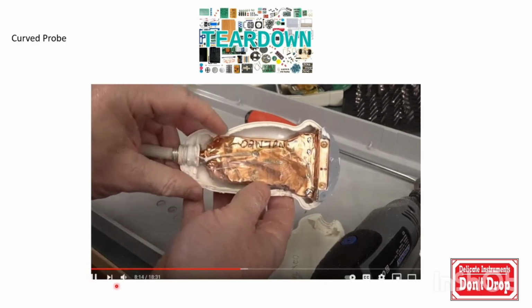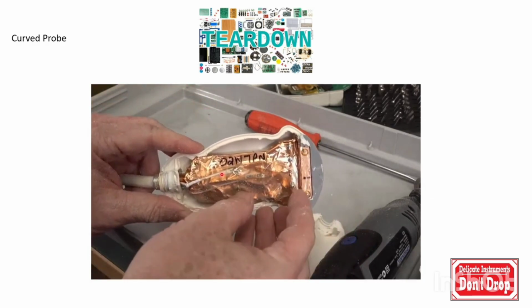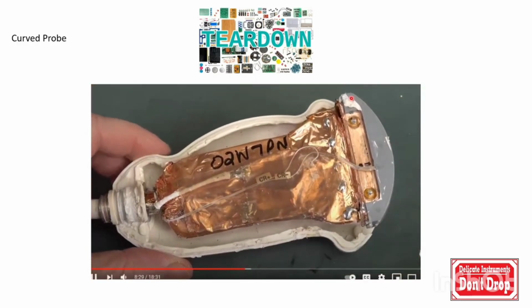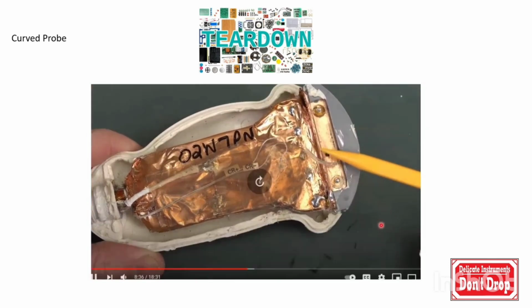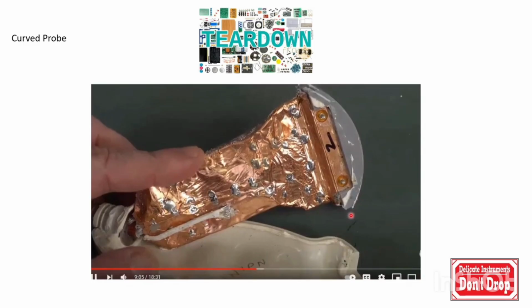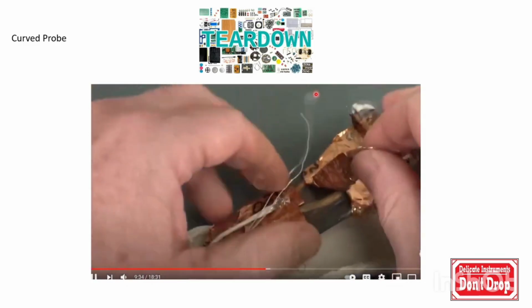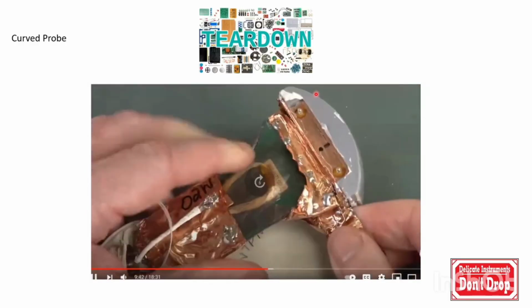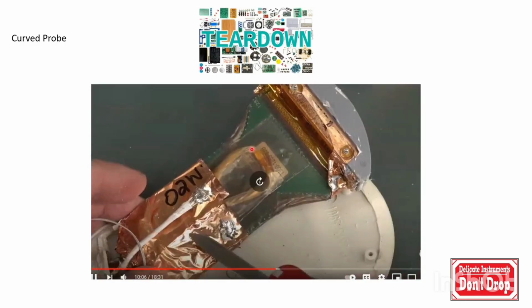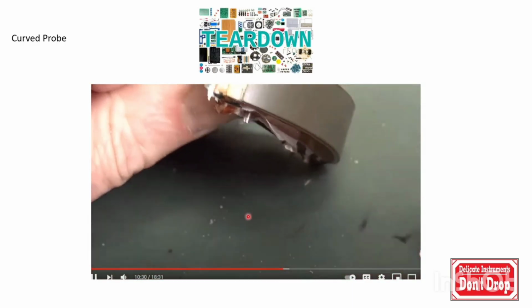Inside that, the piezoelectric crystal is not sitting here. Actually, all these are microcircuits. That is a long wire that is going. The piezoelectric crystal is situated exactly here at this curvature. It is at the tip, not inside, so it is very much exposed. We have to think that a large piezoelectric crystal is cut down into very small pieces and fixtures. These are the electrical wires or circuits that connect, so the current is passed through.